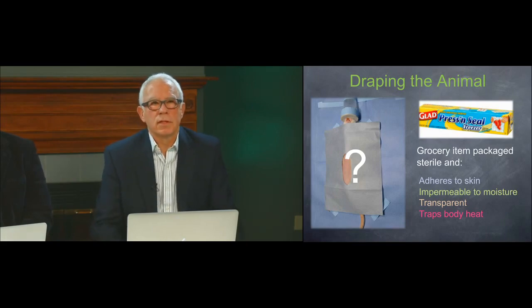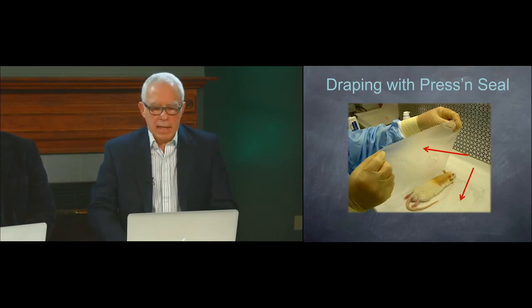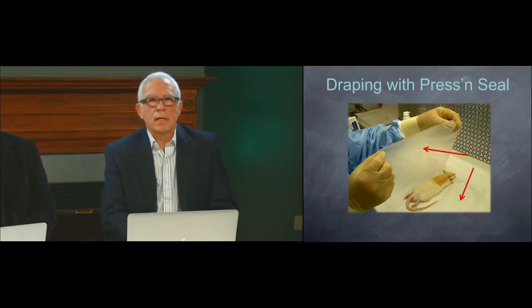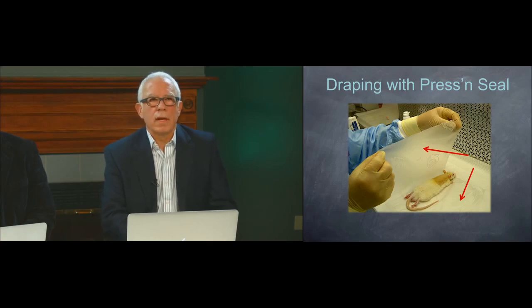Look at this picture. This is a great picture that I have received from Charles River. Give credit to them. Thank you, Charles River. And this animal right here is undergoing surgery on the neck, on the throat. It's a catheterization of the jugular vein, and that jugular vein is going to be tunneled under the skin and brought out between the shoulder blades here.